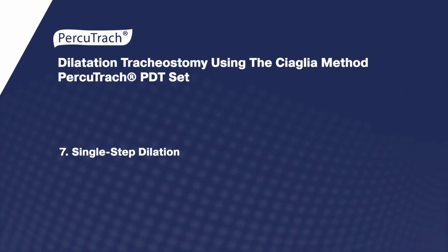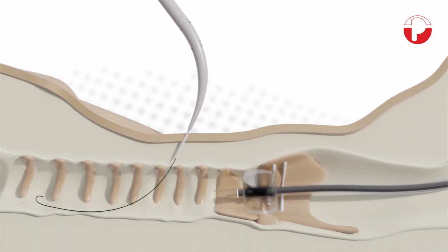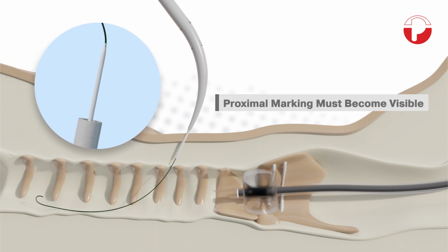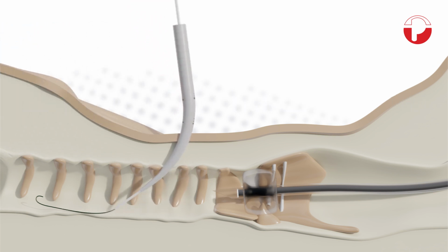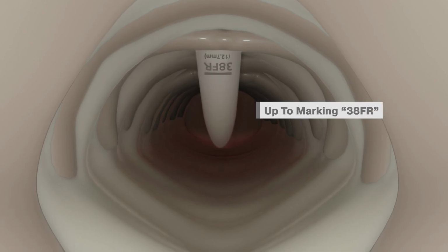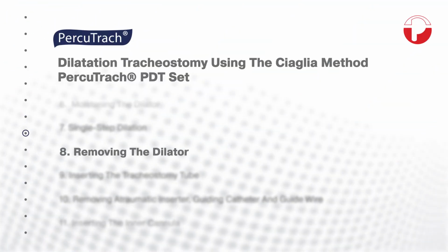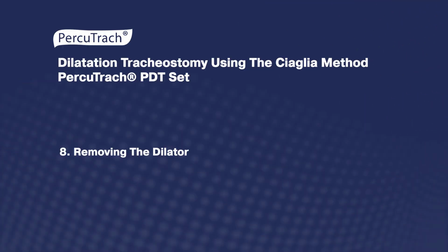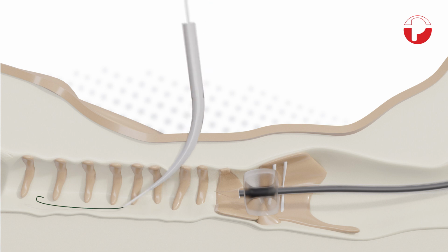The dilator with inserted guiding catheter is threaded over the Seldinger guide wire until the safety lock of the guiding catheter reaches skin level. In the process, the proximal marking of the wire must become visible. By pushing forward and back several times, the tracheal opening can now be dilated until the marking 38 French is visible in the tracheal lumen by using the bronchoscope. Next, the dilator is removed. The guiding catheter and Seldinger guide wire remain in the trachea.